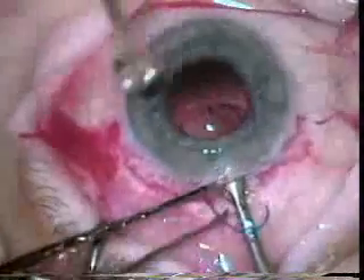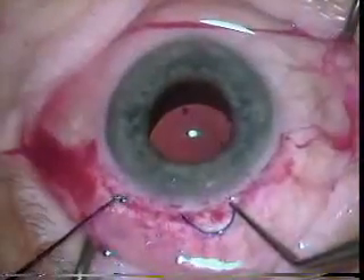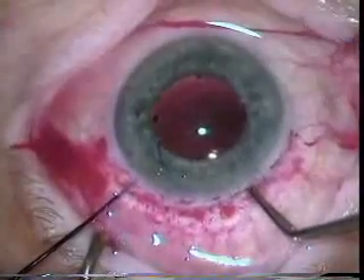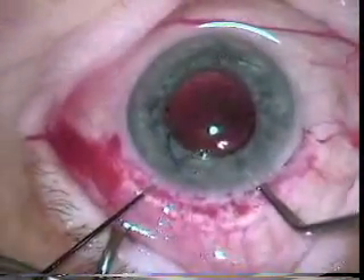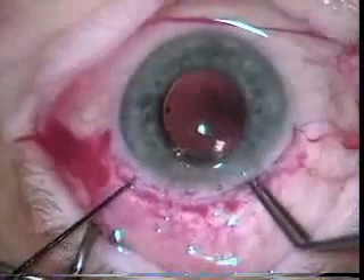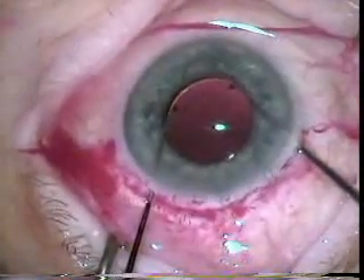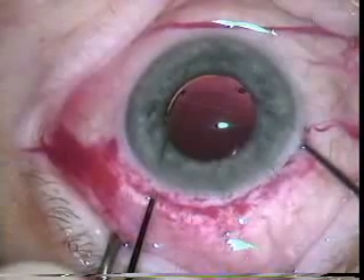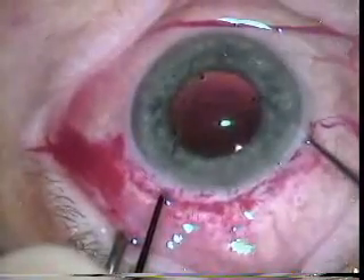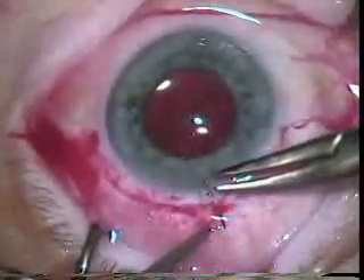The lens has four positioning holes which were useful to get the lens in just the right position. Unfortunately, the positioning holes sometimes would get in the way if the lens decentered, so positioning holes are sort of out of vogue now. Dr. Colder is again using a two-handed technique to gently place this into the capsular bag. Now he's using two hooks to dial this lens — it takes a lot of coordination — and he would dial the lens in an attempt to get the haptics into the bag. One of the things that was hard with the extra cap was to get both haptics into the bag because the anterior capsule was not very well defined.